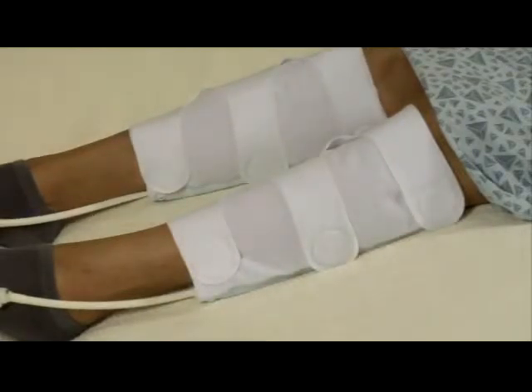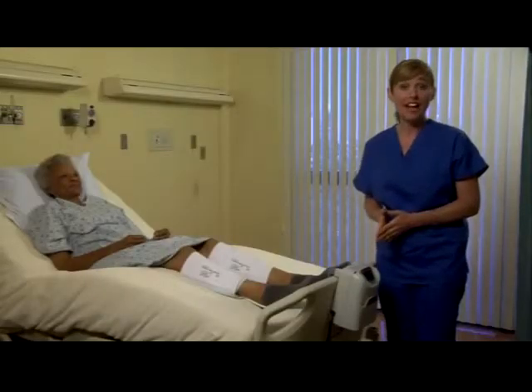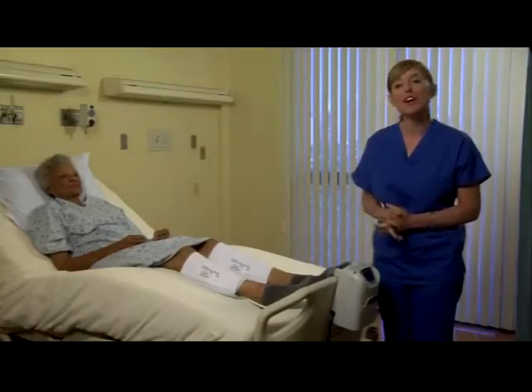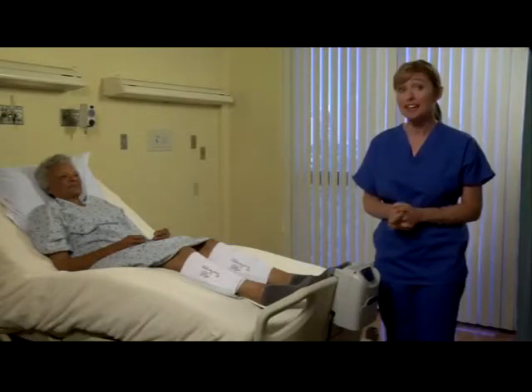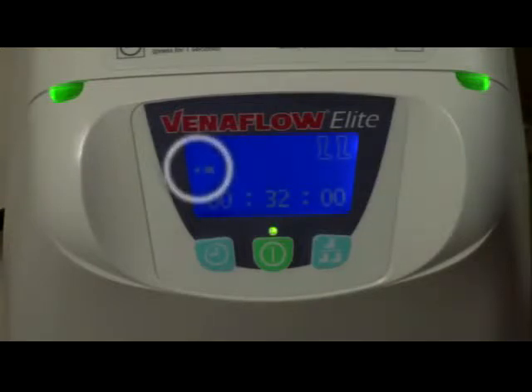Then the proximal air cell inflates a fraction of a second later. After six seconds, the cuffs deflate. If you'd like a single leg application only, you must wait for cuff detection to complete at 100%, and then the screen will switch to ramp-up. The screen will show a diamond icon on the left side indicating ramp-up. When that diamond is gone, ramp-up is complete.